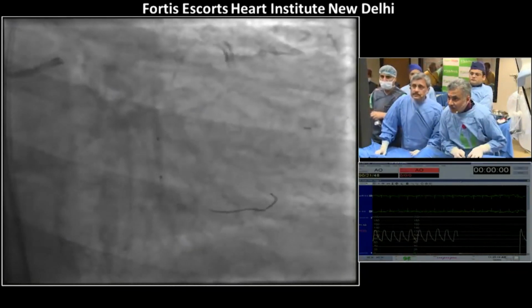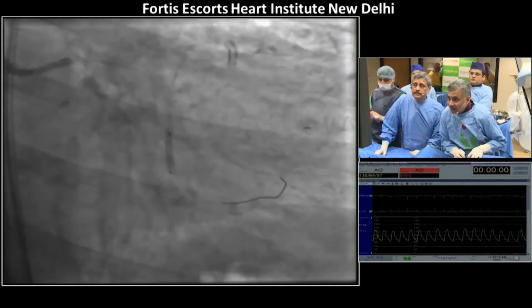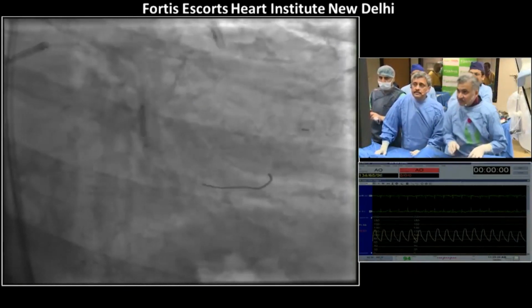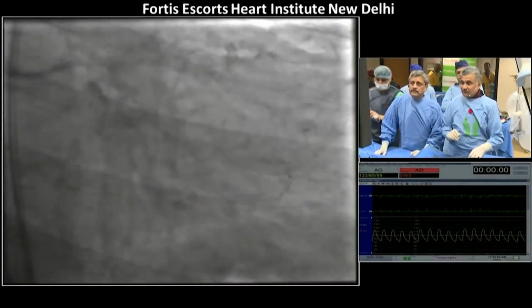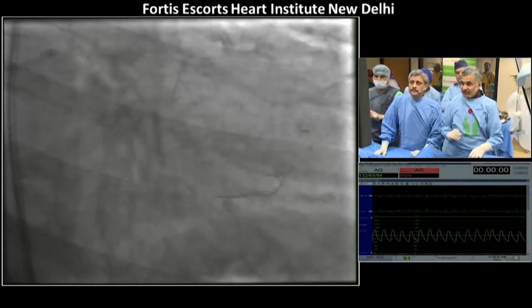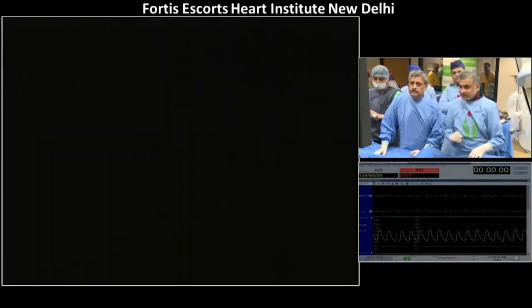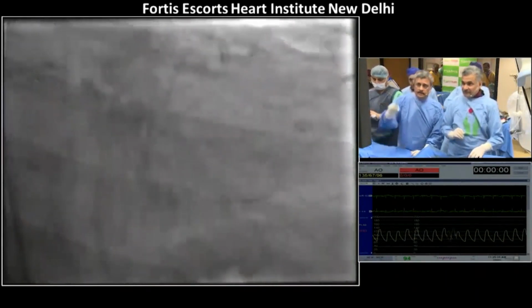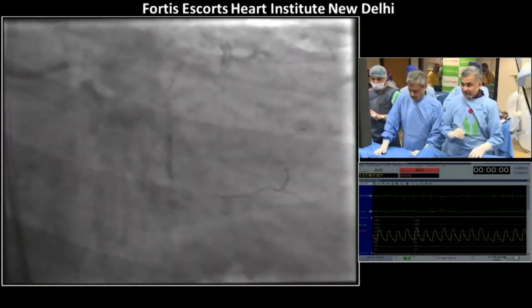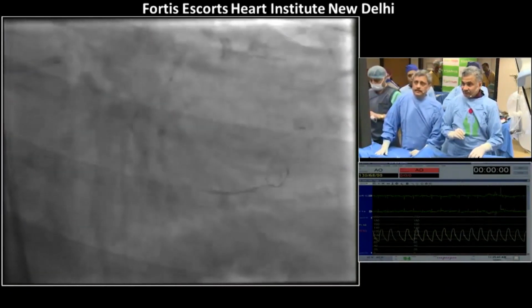Okay, go up. 1, 2, 3, 4, 5, 6, 7, 8, 9, 10, 11, 12, 13, 14, 15, 16. Even with all that, the TBR will be about 20% in this patient, but this vessel is very small. There's a fibrotic area over there. Is she having any pain? That's the most important thing I want to ask.